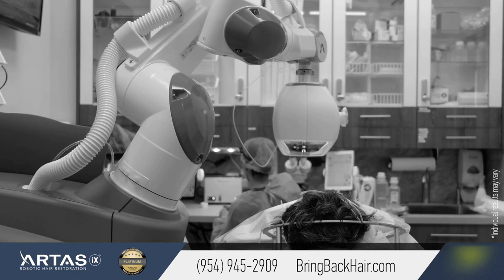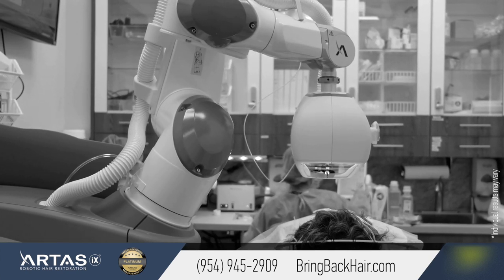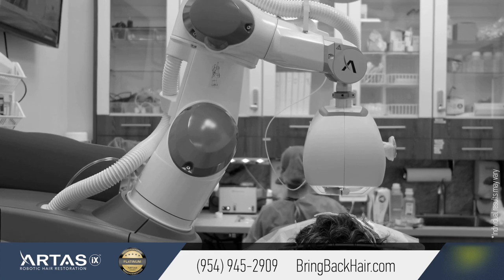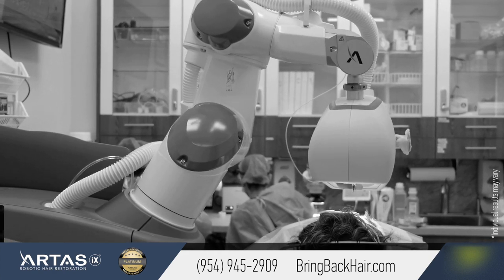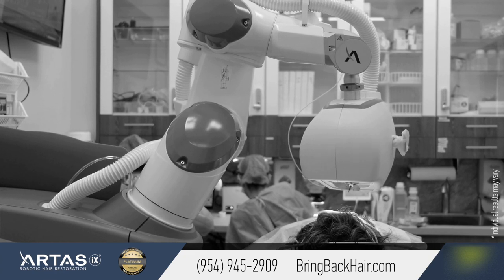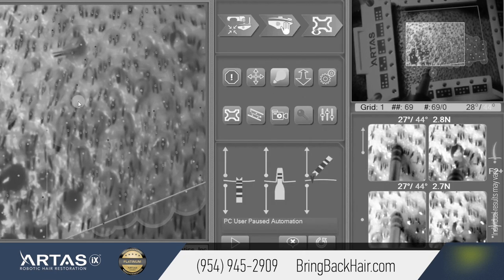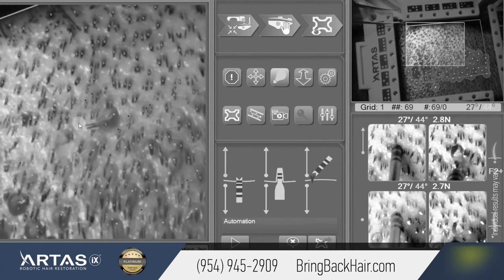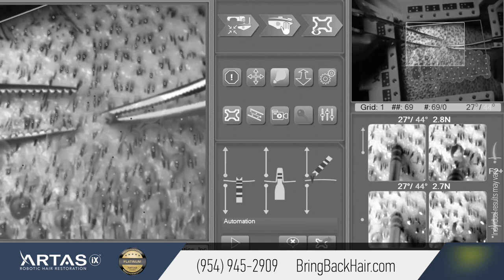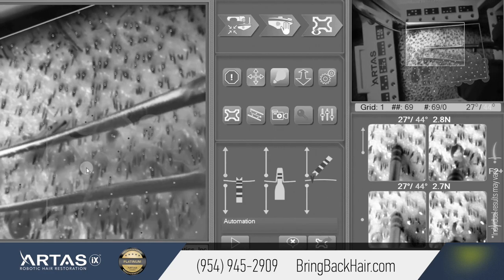We're about in the middle of the procedure. What makes the iX different is that the robot actually finds the area to work by itself. Now we can show the screen here — we've finished about 560 grafts and they're all looking very good. We're going to start harvesting.